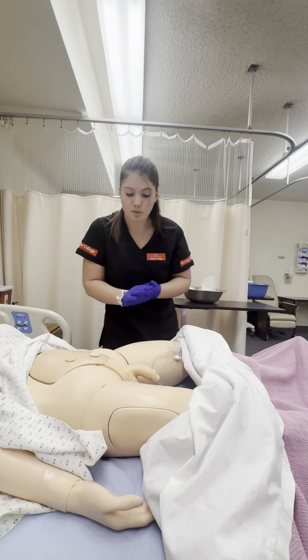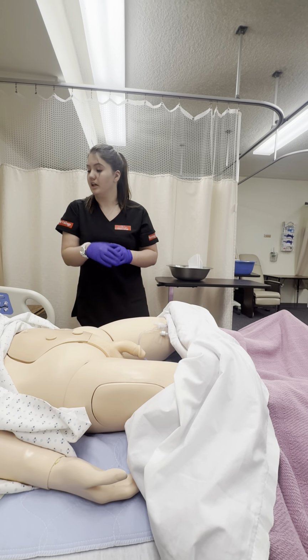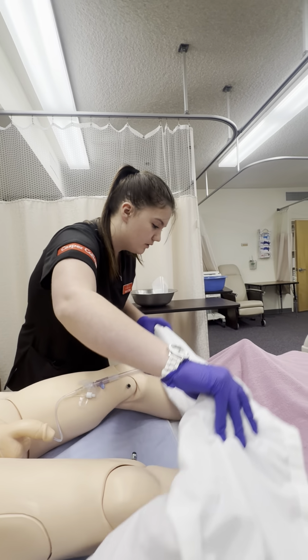So it looks like you should be all set. I'm going to go ahead and make sure that we drain everything from your catheter, and then we will go ahead and get it removed, okay? Okay. All right, so what we're going to do, I'm going to go ahead and move this down all the way.